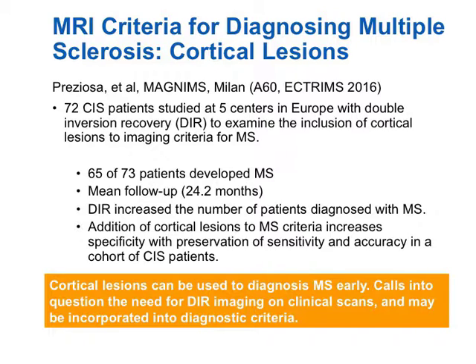And as we know, the suggestion of using cortical lesions has already been incorporated into the MAGNIMS MRI criteria, and with the revised diagnostic criteria that are likely to be published next year, these may make it into the new diagnostic criteria. Therefore, it will be a clinically relevant topic for clinicians.